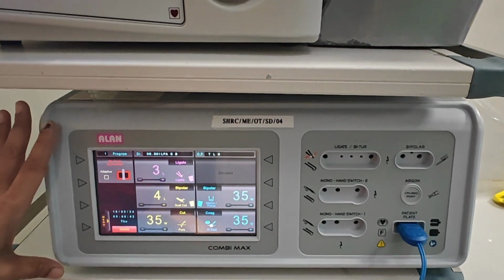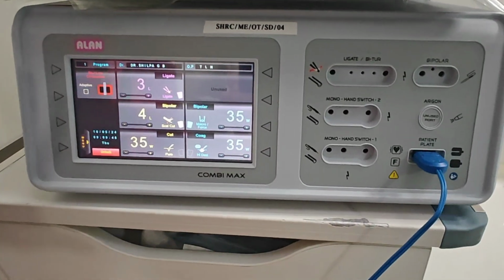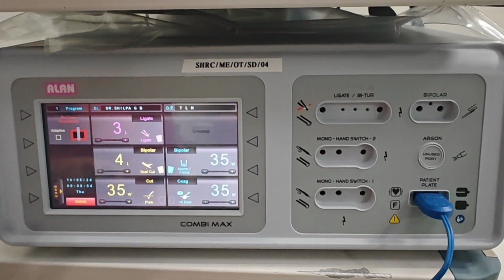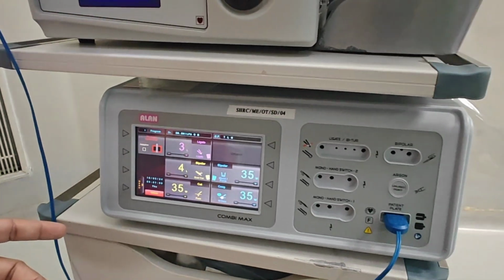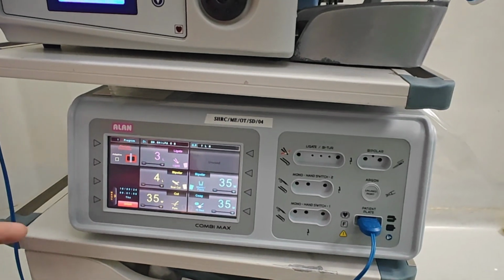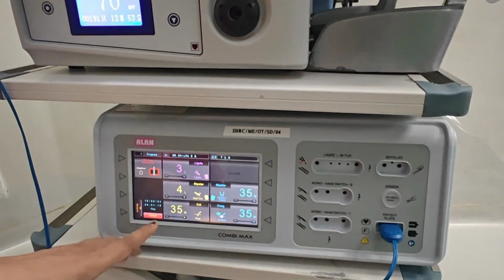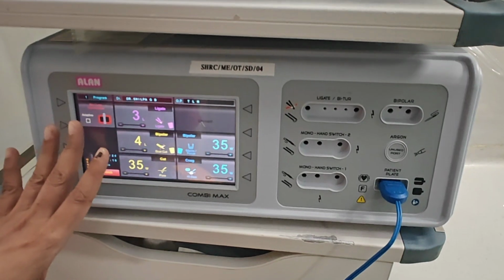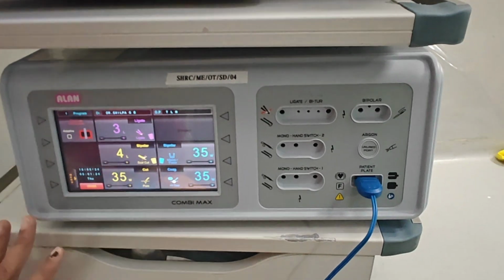So this instrument works extremely well where there is both cutting and coagulation with the same instrument. This helps in preventing damage to the tissues, because these are advanced bipolar instruments. The technique that the instrument uses is radio frequency waves, that is the heat wave, which is used to coagulate and also cut depending on the voltage and amplitude of the current which is generated.